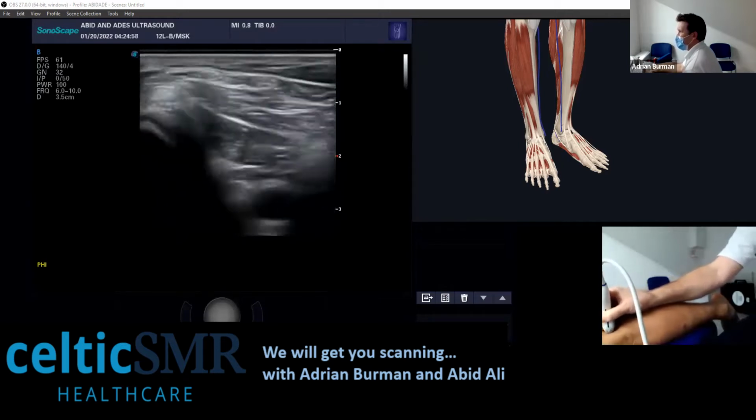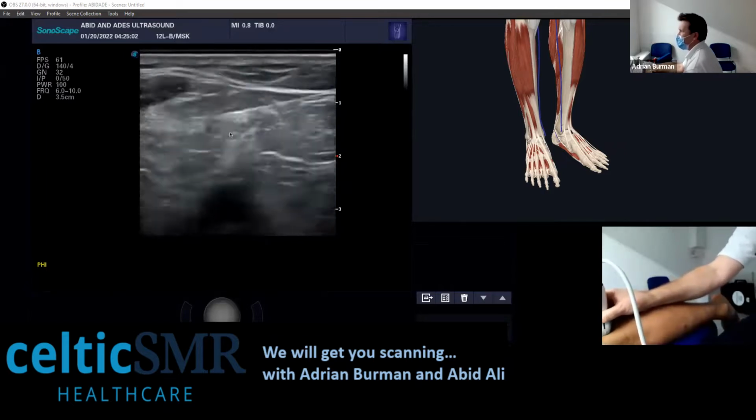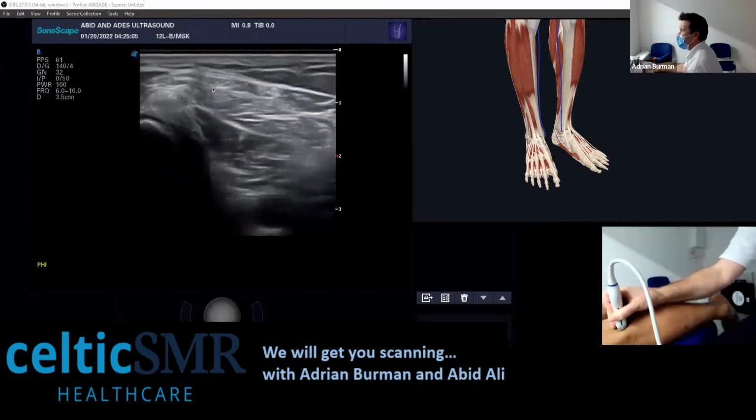This one's actually an unusual course. So there it is there.